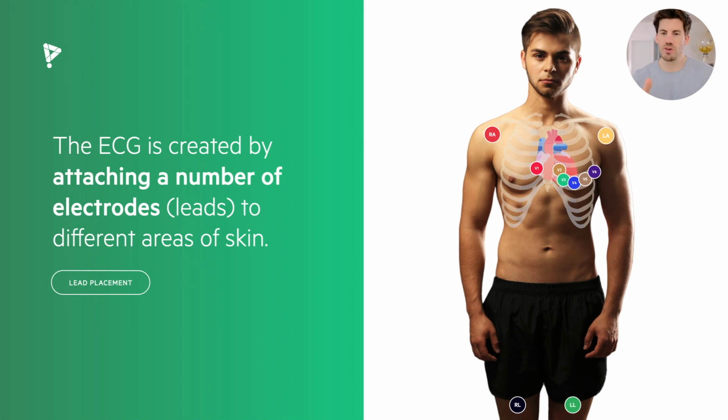And then we have the locations of the chest leads going across the chest, okay? Generally, the 4th intercostal space on the right side for the first lead, the 4th intercostal space on the left side adjacent to the sternum, and then they're going round in the corner at different set locations, okay? And this is the principle for forming a 12-lead ECG.